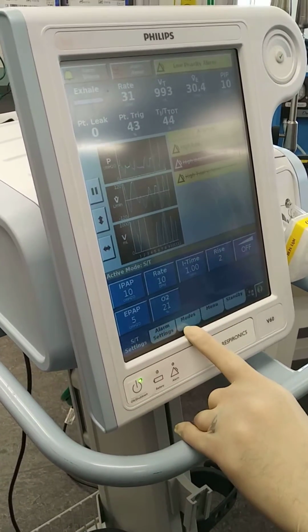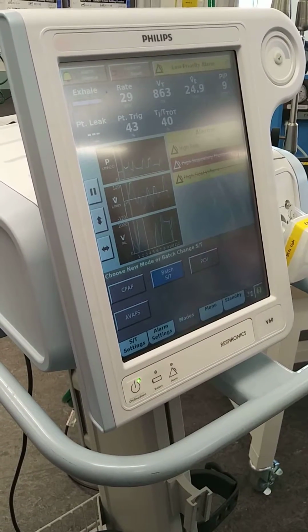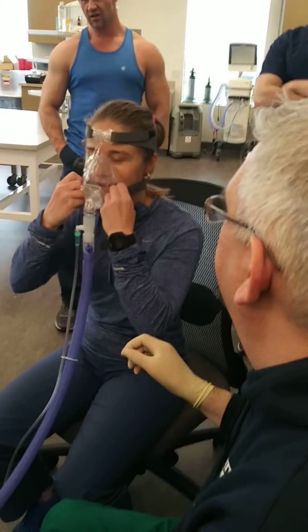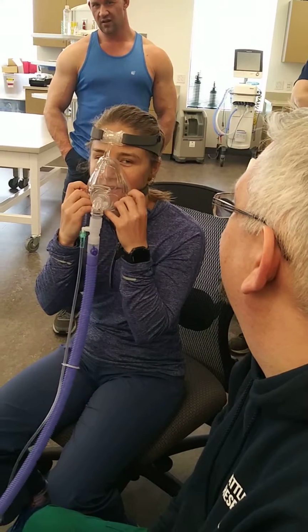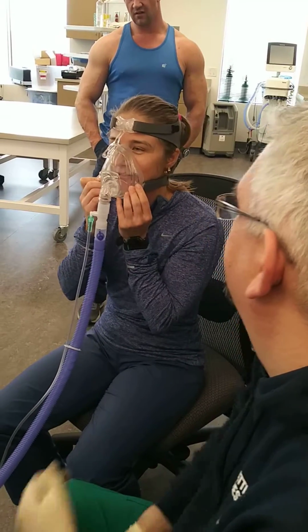Okay, so before I take it off here, let's do this. By the way, I told you how to take it off. Reach up with your hand. You can grab these clips and pull them forward, and it'll come off. Okay. There you go. And that's how you would do it if you needed to. Now if I hold my breath, it'll try to deliver a breath. Try it.